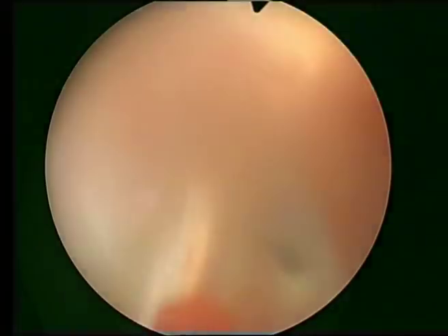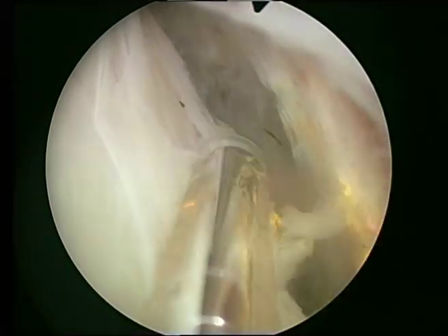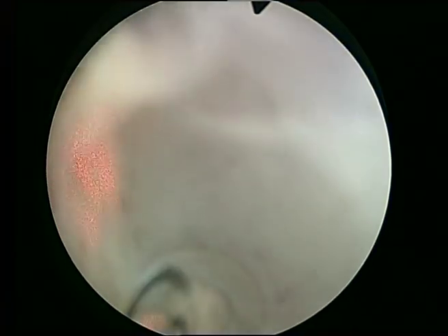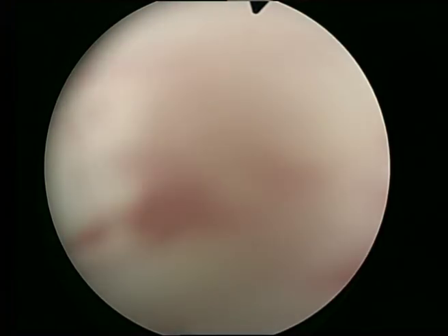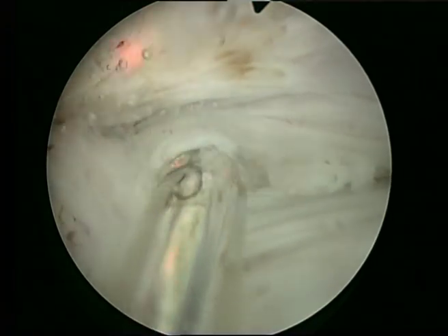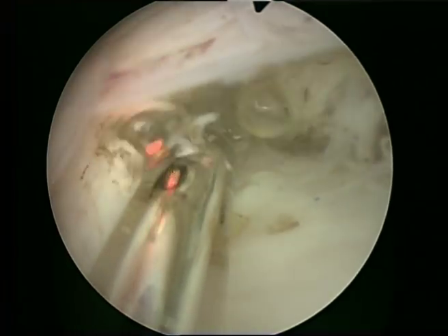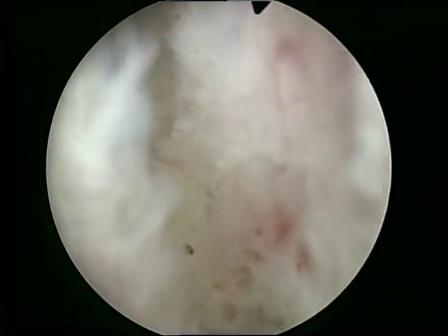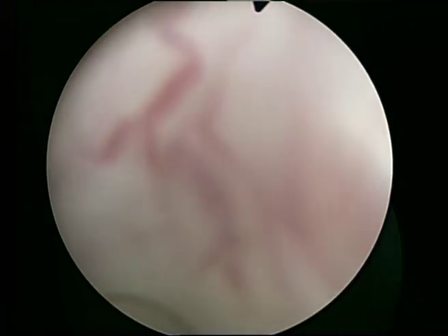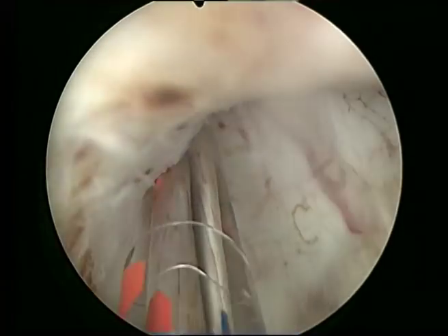The other setting I use for vaporization is 80 watts. With 40 watts for coagulation and 80 watts for vaporization, I have a range of possibilities — I can coagulate, I can cut tissue at higher powers, and depending on how I manipulate the fiber — slower or faster rotation, closer to or further away from the tissue — I can get an array of different tissue effects. This allows me to coagulate and cut fibrous attachments of the adenoma to the capsule without a lot of energy dispersal or energy damage to the capsule. Here we are progressing and approaching the bladder neck area.